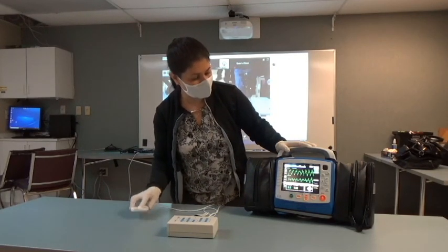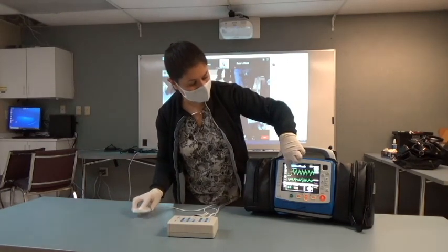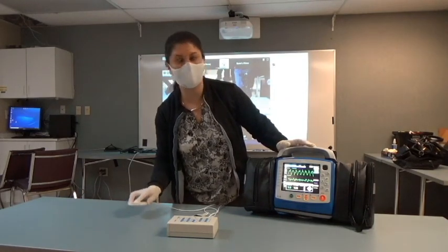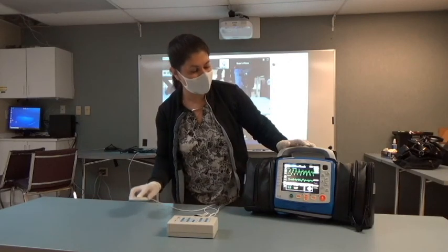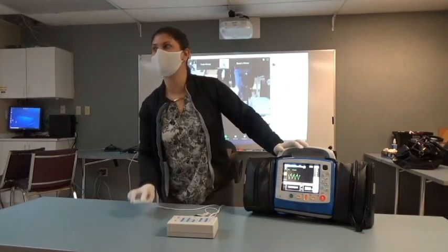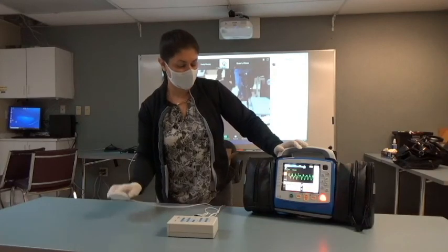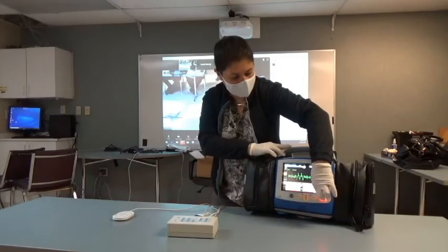The next piece of information this will pull is the underlining rhythm. So through a compression, we can filter out about 90% of the artifact to give you the underlining rhythm so that we encourage you to stay on the chest and pre-charge. If I'm at my last 10 seconds, I'm going to pre-charge, continue compressions. I want to come off the chest. Is that V-fib? Yes. Everybody clear? Deliver.